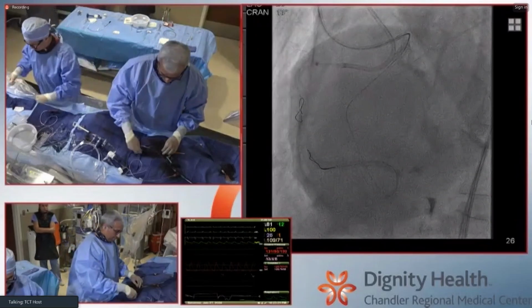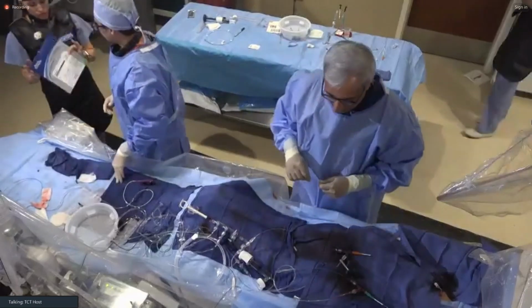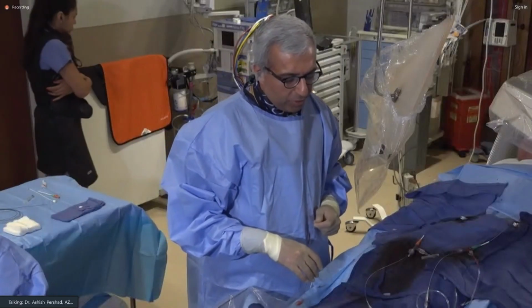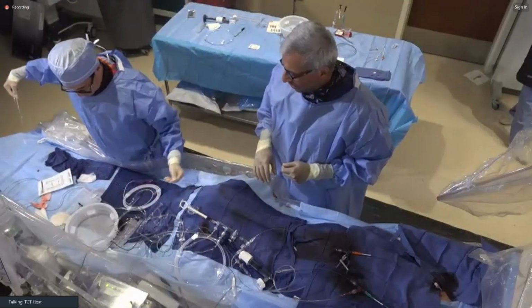Though, you know, the spiral with this amount of calcium, it's great when you manage to get it into the intraplaque segment, but it's hard to first make entry, that transition past the proximal cap, right? Sometimes, I've noticed with the other ones, you potentially could lose the tip in the calcium. Rarely, but that's an issue, which is why I'm a little hesitant.